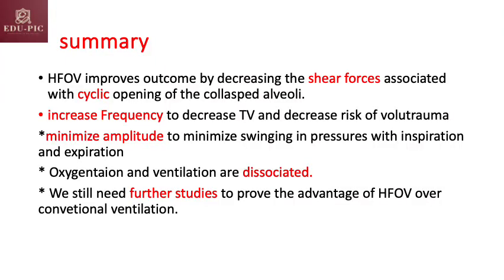In summary, we can say high-frequency oscillatory ventilation improves the outcome by decreasing the shear forces associated with the cyclic opening of the collapsed alveoli, increasing frequency to decrease the tidal volume and decrease the risk of volutrauma, and minimizing amplitude to minimize swinging in pressures with inspiration and expiration. Oxygenation and ventilation are dissociated. We still need further studies to prove the advantage of high-frequency oscillatory ventilation over conventional ventilation.